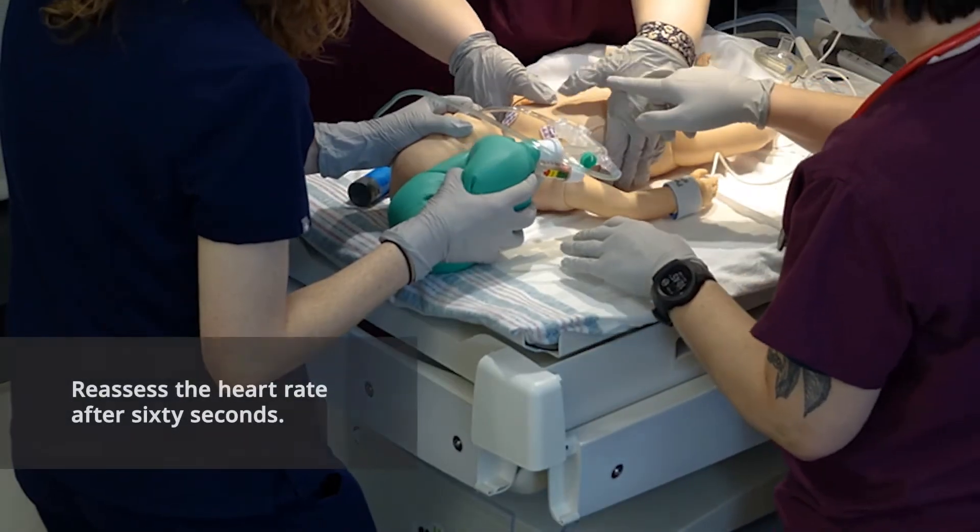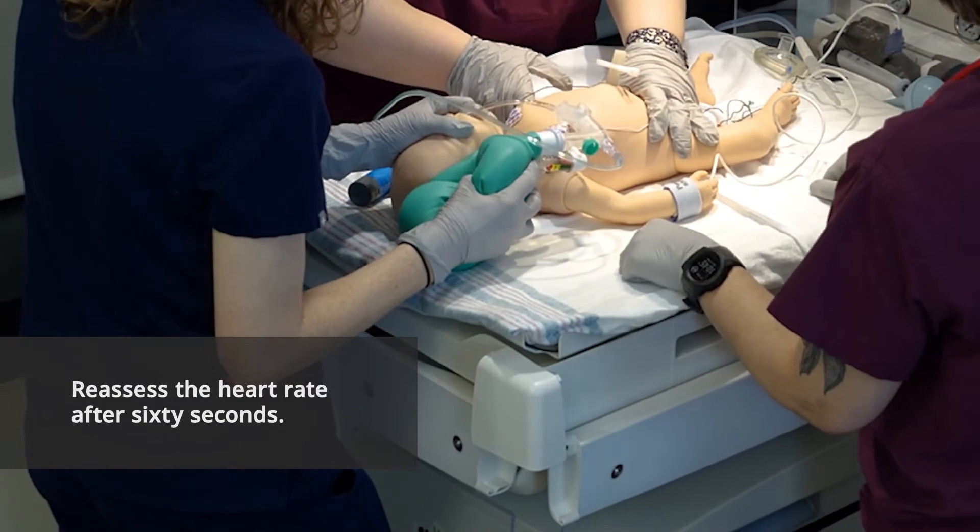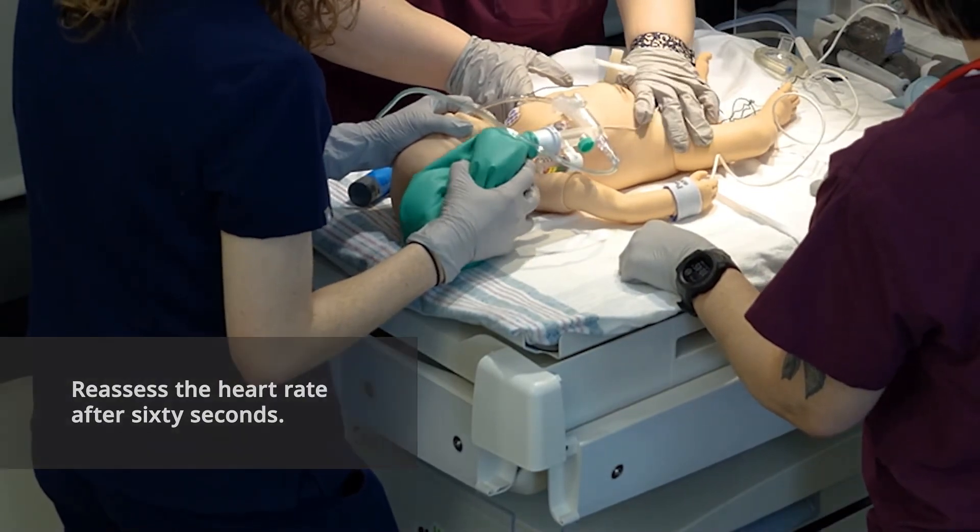We're at a minute, so let's pause compressions. Keep bagging. Okay, our heart rate is still less than 60. Let's resume chest compressions.